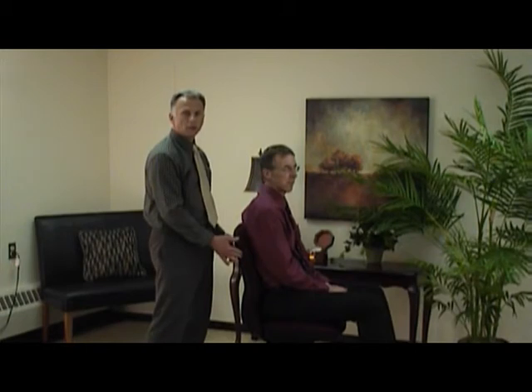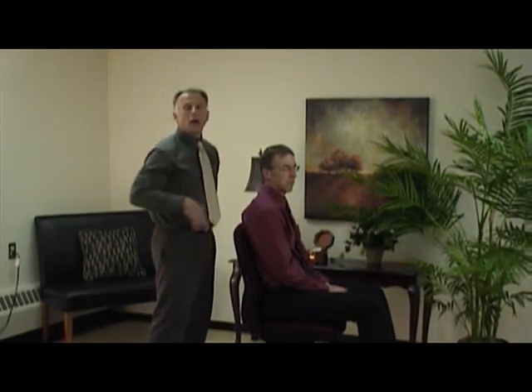Sometimes you may have your lumbar support in after 20 minutes of sitting there. You may need to adjust it after another 20 minutes to adjust it back down. That way you get some motion in the lumbar vertebra, and it helps circulation and it makes it more comfortable as well.